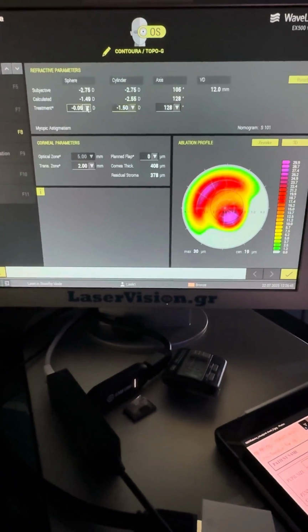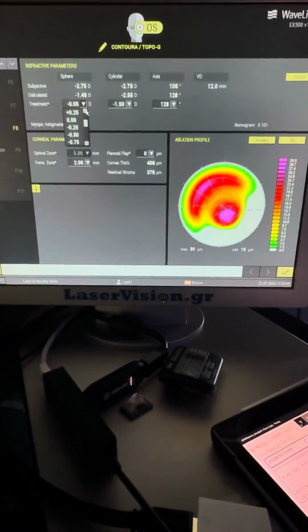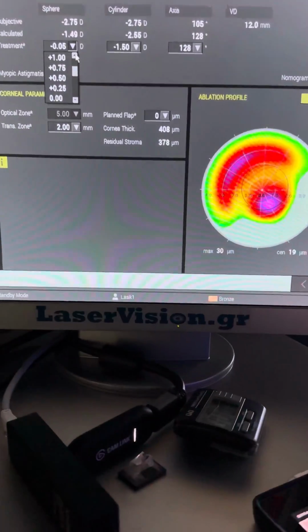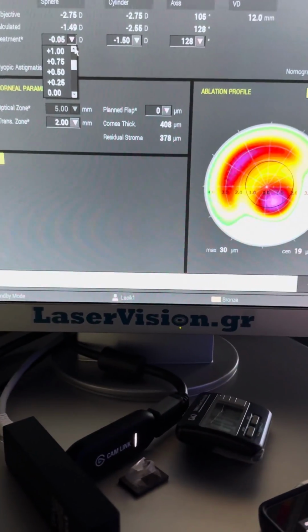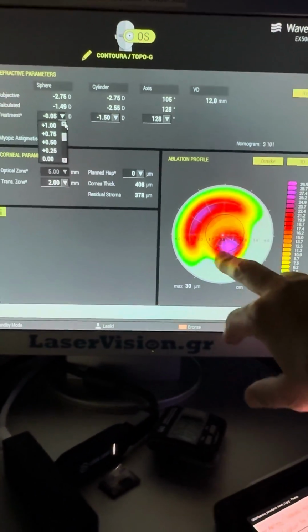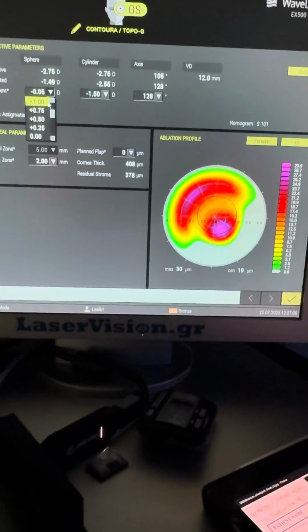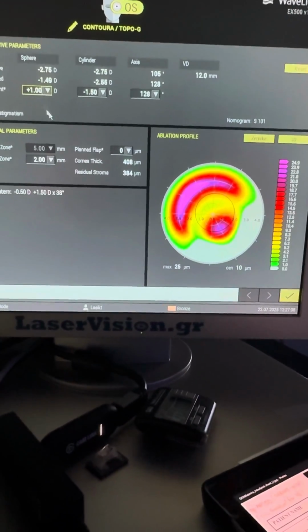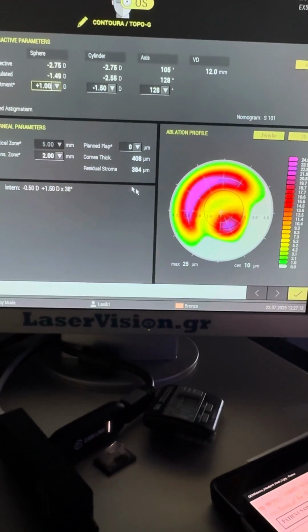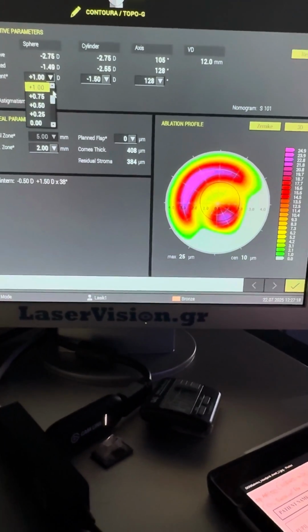So we will arbitrarily treat hyperopic. You do not have this option in the US, so we have to talk separately on how to do this in the United States. What I'm trying to do here is take away all the treatment that we performed in the central cornea, or in the thinnest part of the cornea. So if I put a +1, look how this treatment is converted. It's hotter in the periphery, and see that we've increased the transition zone. It's weaker over the cone. And we said the cone has really no room to work.